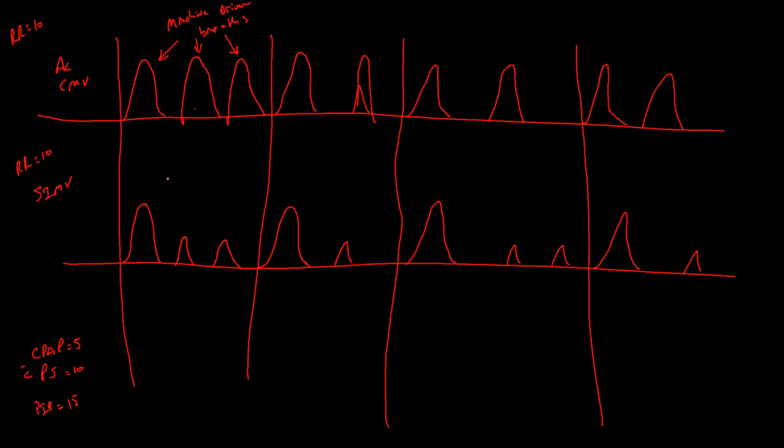Okay. I'm going to write the same thing here. Machine-driven breaths. But now these are breaths that the machine will give you one every 6 seconds. But if you take your own, you're only breathing in like a 200 tidal volume, whatever tidal volume you take in.